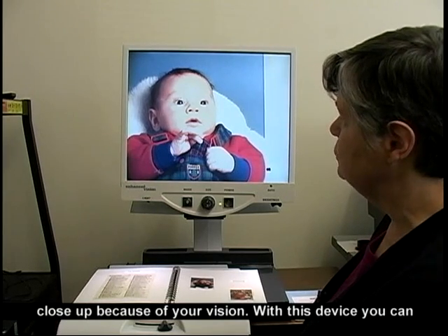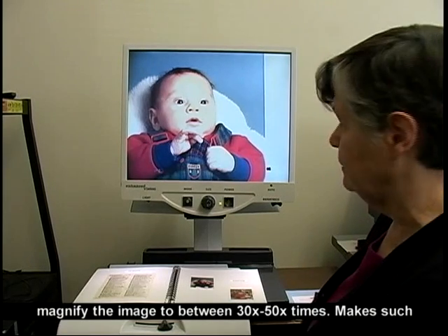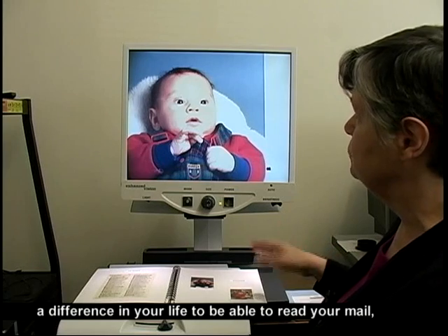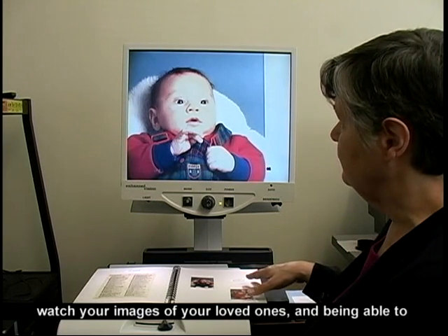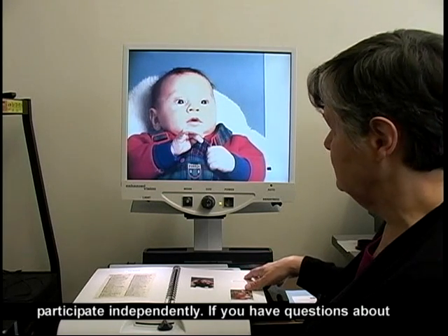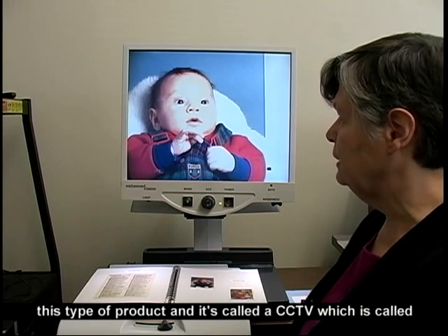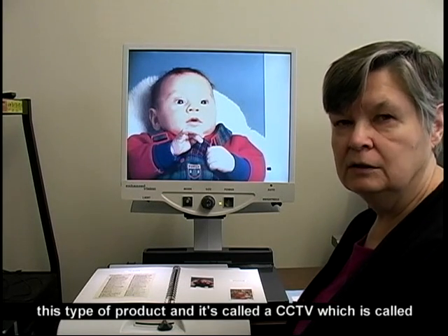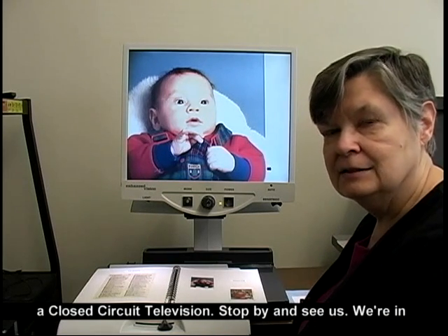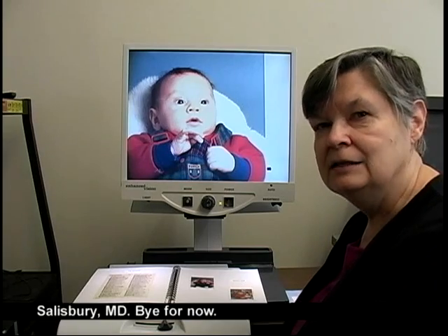With this device, you can magnify the image to between 30 and 50 times. It makes such a difference in your life to be able to read your mail, view images of your loved ones, and participate independently. If you have questions about this type of product — it's called a CCTV, which stands for closed circuit television — stop by and see us. We're in the Senior Services Building behind the Holley Center in Salisbury, Maryland.